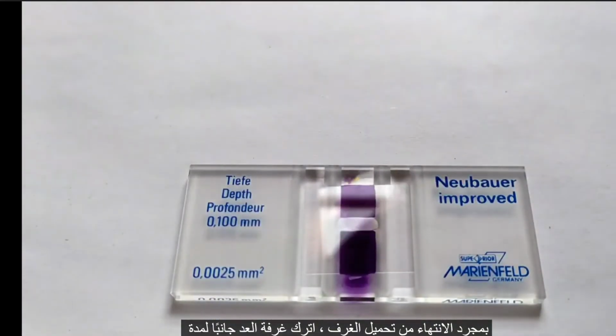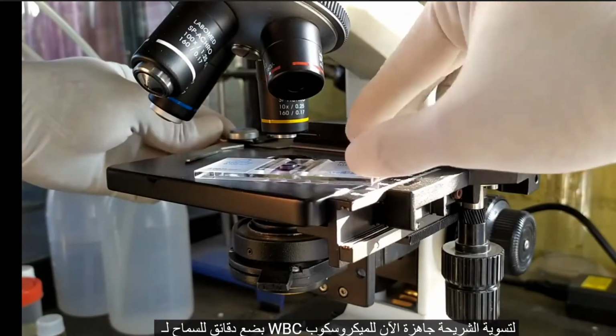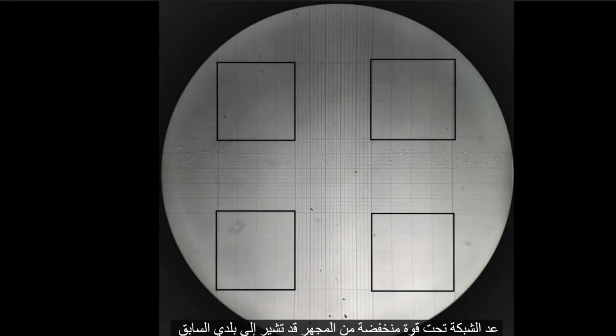Once you're done loading the chambers, keep aside the counting chamber for a few minutes to allow the WBCs to settle. The slide is now ready for microscopic observation. First, locate the large squares at the four corners of the counting grid under low power of the microscope. You may refer to my previous videos on hemocytometer to see which of the squares in the counting chamber are to be used for WBC counting.